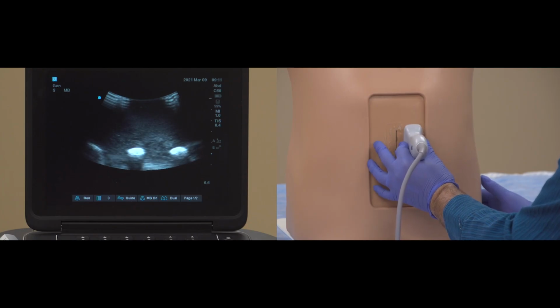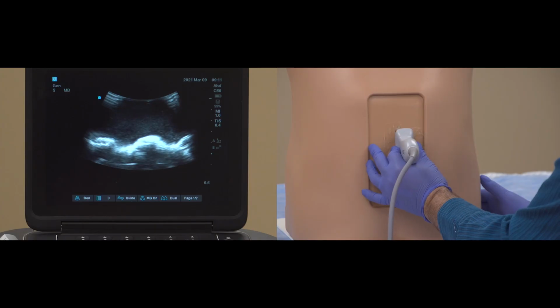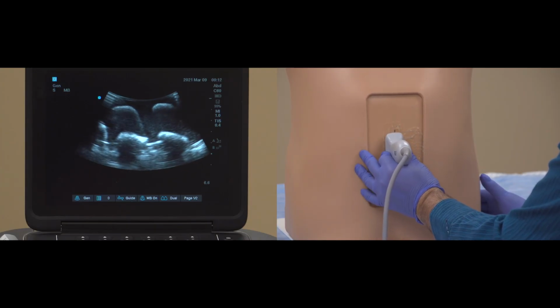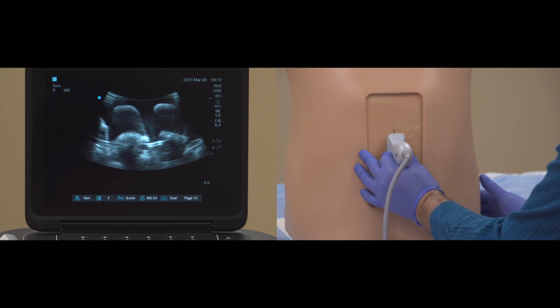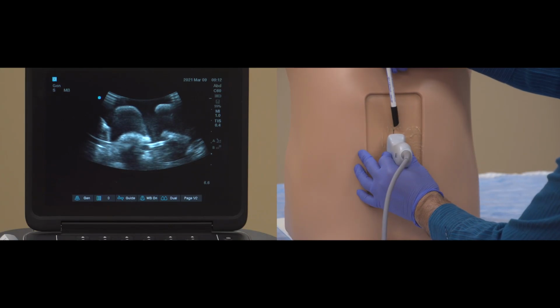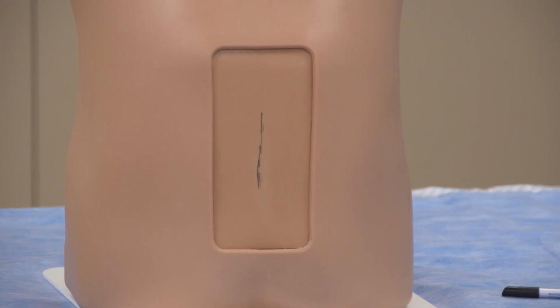Sliding medially, next you will see the waves of the lamina. Sliding medially again, you will see the spinous processes as islands rising out of the waves. Center the transducer such that the spinous processes extend across the screen. You may need to make a slight rotation with the probe to achieve this. Once centered over the spinous processes, confirm that the long axis of the probe is in line with your marked midline. Note that this initial midline mark can highlight spinal curvature deformity.